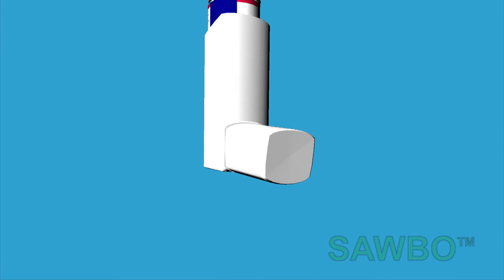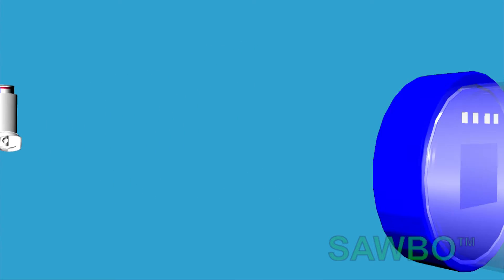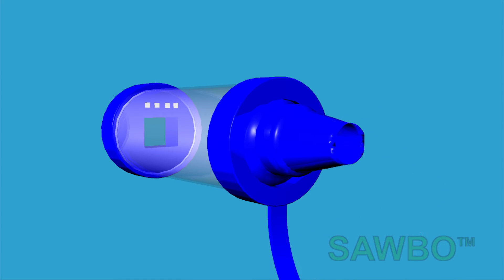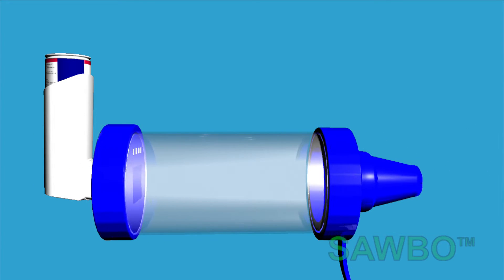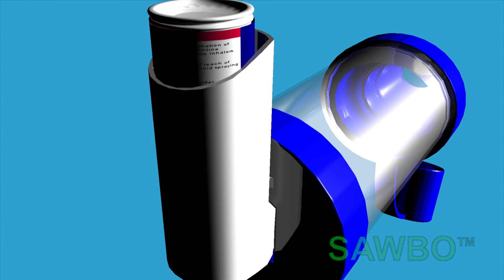Shake. Cap off. Place the inhaler in the back of the spacer. Push down and inhale.